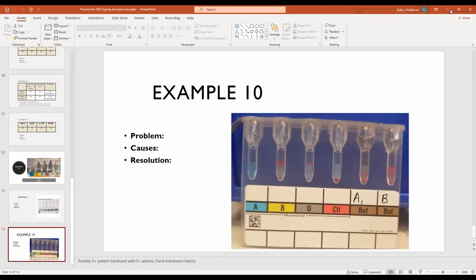And that's another thing. When you have non-specific reactions, you're thinking it's a non-specific protein or something causing it. Because if it's reacting with all cells equally, it's not a reaction to an actual antigen. So it's not an antibody reaction. It's a non-specific protein reaction.